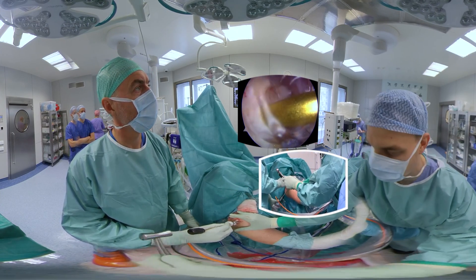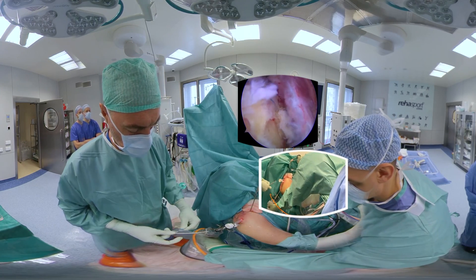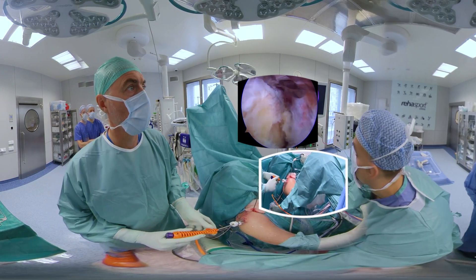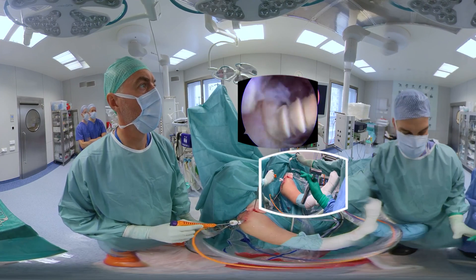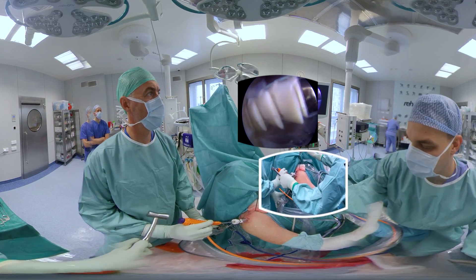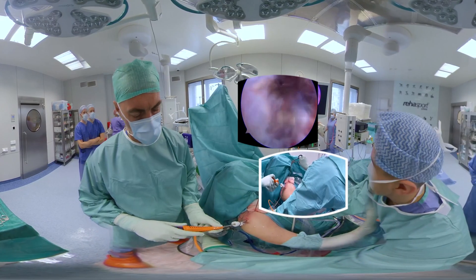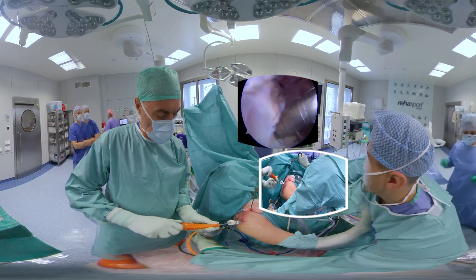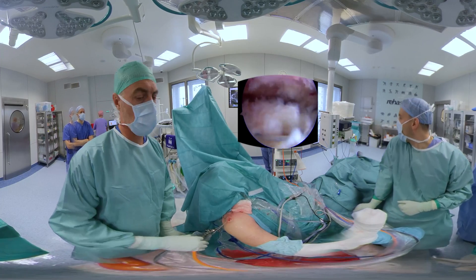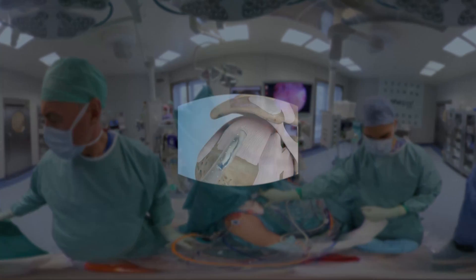The same maneuvers are performed for the posterior lateral anchor. Again, one anterior and one posterior suture is used to compress the tendon against the footprint. After the final construct is achieved, we can clearly see that the tendon is relatively thin and degenerate, and the footprint area is not fully covered. This, for me, is the main indication for application of a collagen membrane like Regenetin.